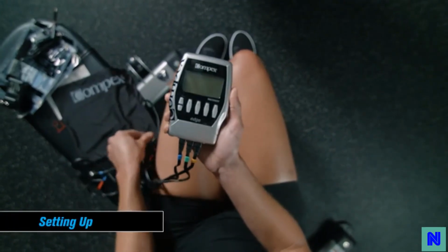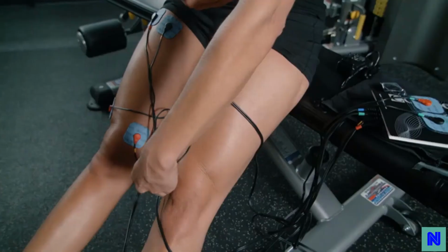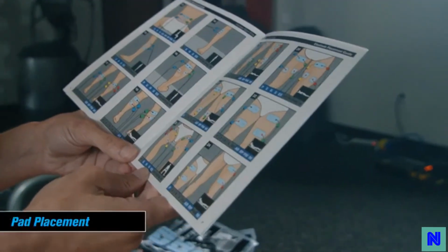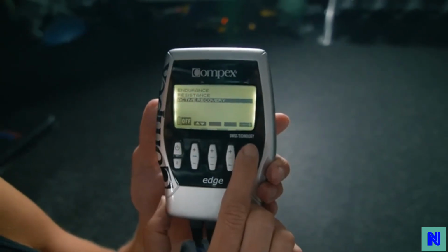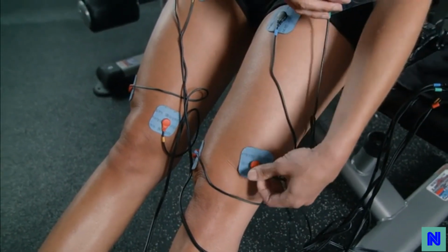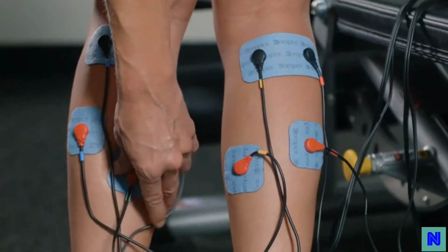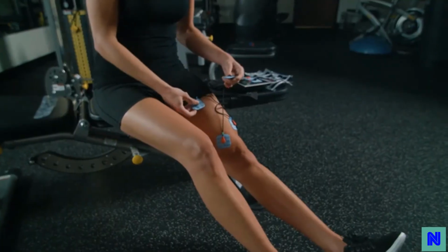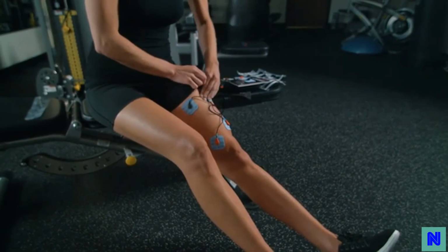The color-coordinated cords make setting up easy. Simply place the matching color cord to the device. To use the pads, snap the end of the cord to the back of the pads. Follow the pad placement guide, which is included in the box. If using the warm-up or recovery program, you can place the pads wherever you'd like. Simply place around the muscle group area that you'd like to work. For the strength programs, place the electrodes at the top and bottom of the muscle group you'd like to work. When placing the electrodes on your body, keep the red away from the heart, while black can be placed closer.